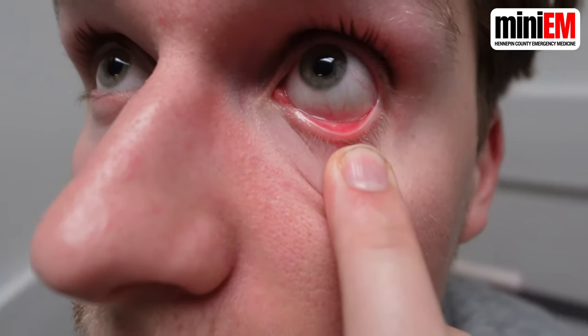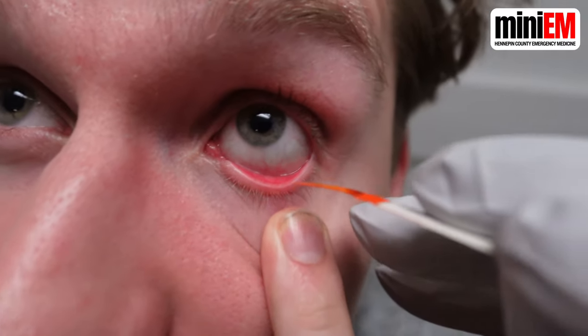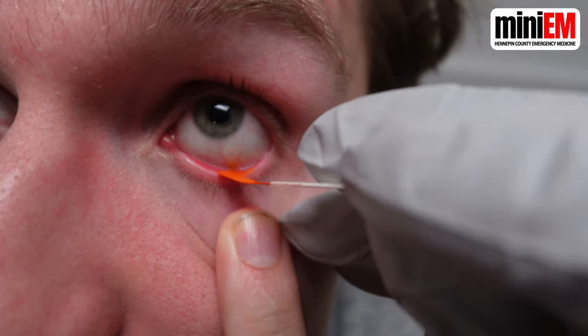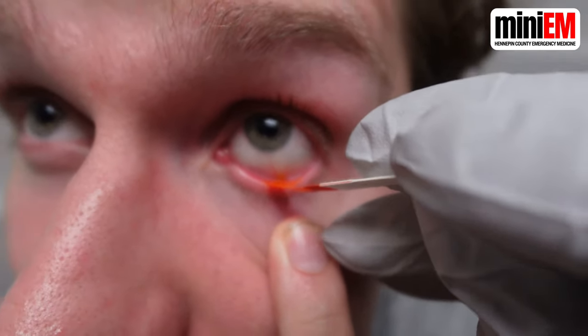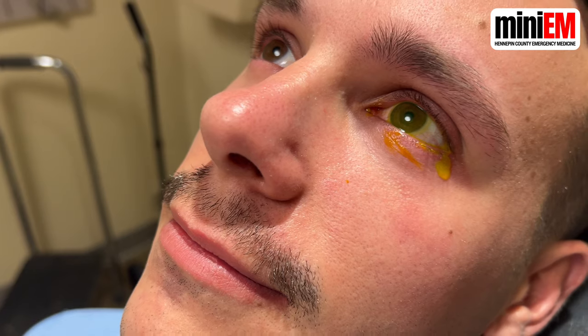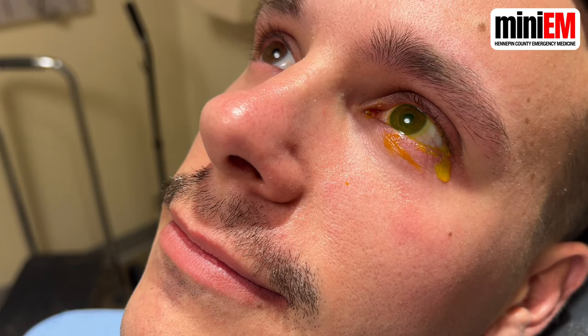Have your patient pull down their lower lid and touch the wet fluorescein paper to their conjunctiva. You want a very thin layer of dye. If the patient's eye gets flooded, have them blot away the dye with a tissue. Remember that this can stain their clothing, so be really careful.